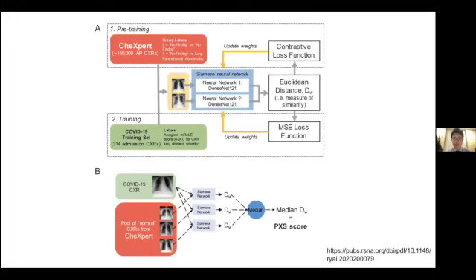What this model allowed us to do is to create a quantitative measure, so a scale, which went from approximately 1 to around 24 for disease severity, where the lower number would mean less density and extent of lung opacity, and the higher number would mean more severe density and extent of lung opacity.